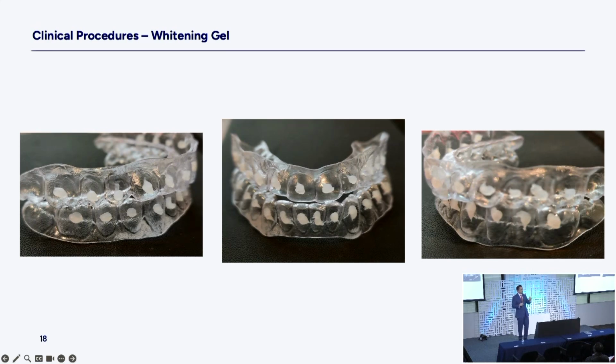Now to be clear, it doesn't mean taking a night off from wearing your aligner. You wear your aligner every night to bed, right? Because remember you're talking to your patients. So when you say take a night off, that's from the gel only, not the aligner wear. You wear your aligner to bed every night. So sensitive teeth get to pace themselves. We teach the patient very simply, whiten your teeth as you are comfortable. You can set up whatever the pattern is that gives you your comfort.